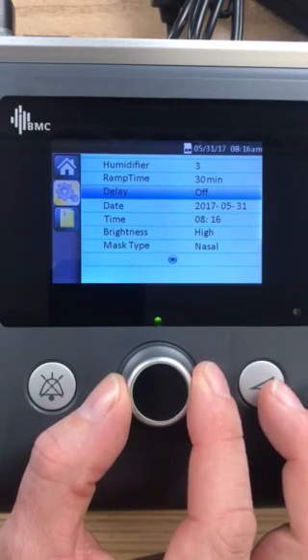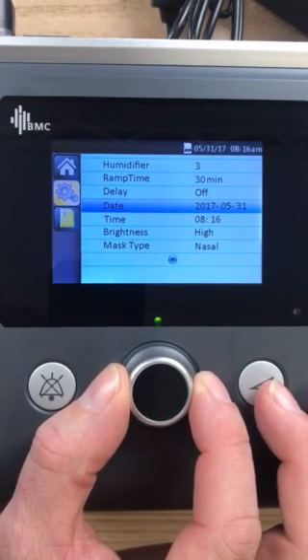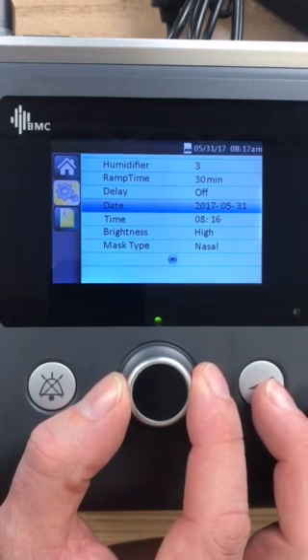Delay, I don't know what that is, unfortunately. Delay, what would that be? No, I don't know what the delay is.